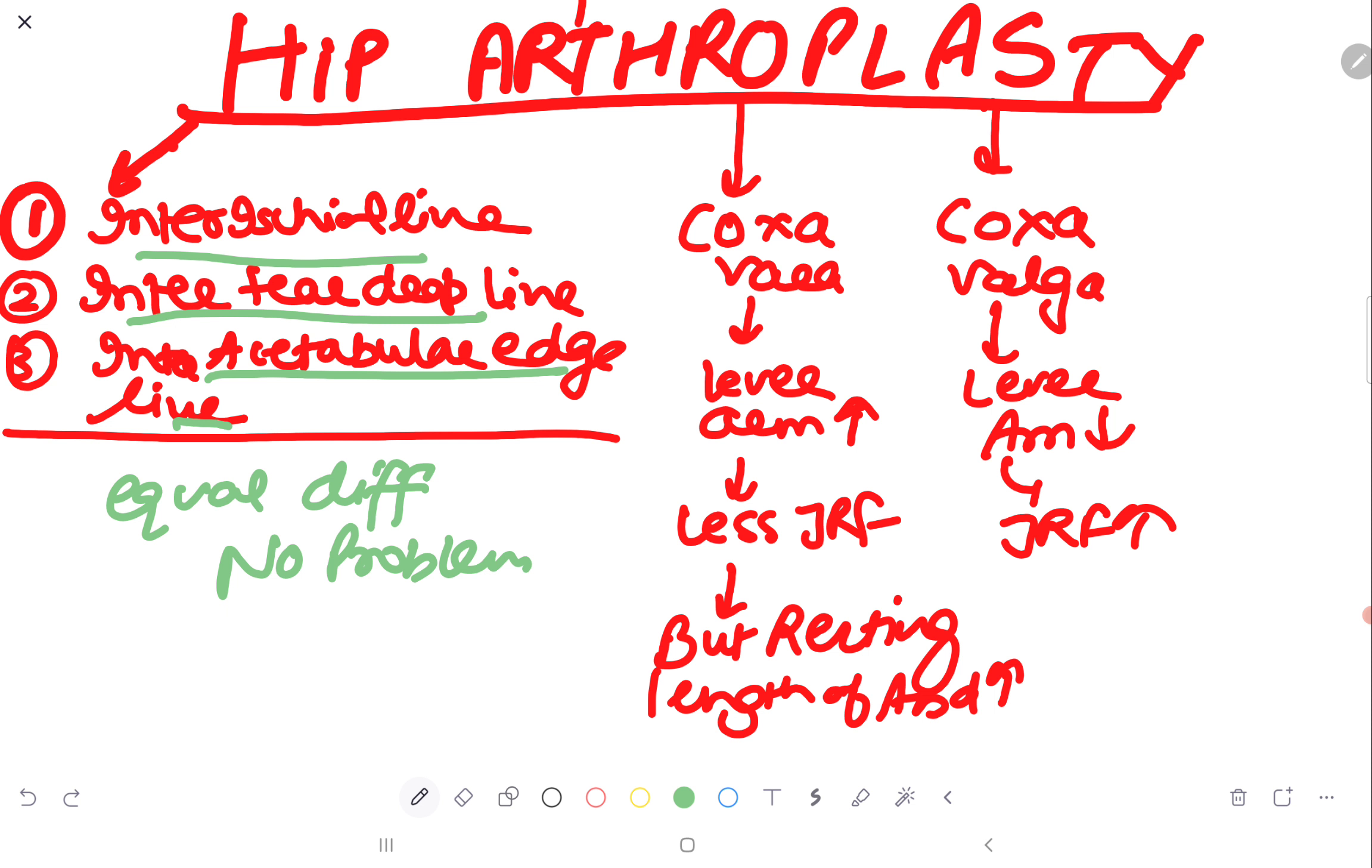Likewise, you will see the difference between inter-teardrop line and inter-ischial line at right or left side. If it is equal, then it means there is no problem at the femoral side.